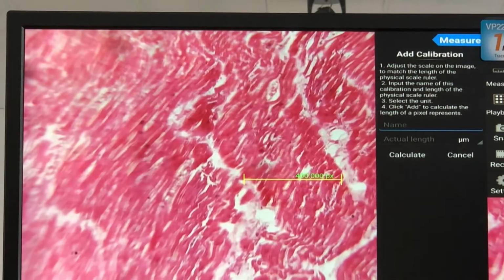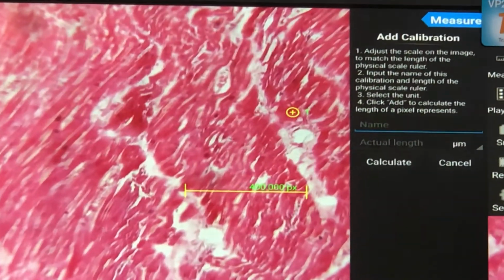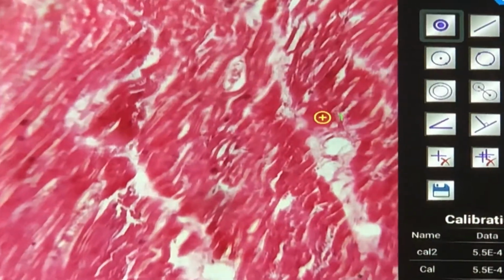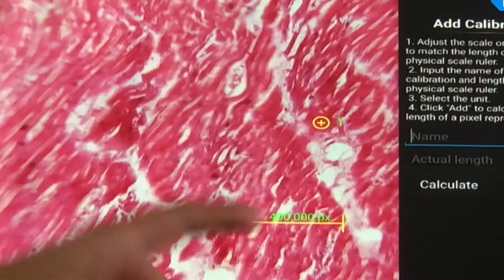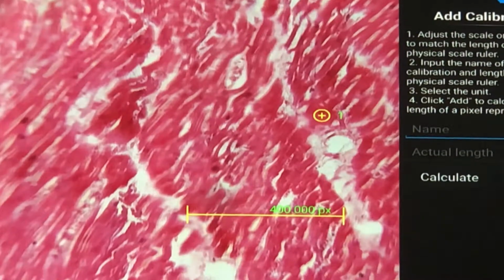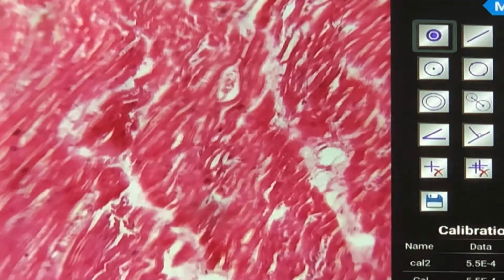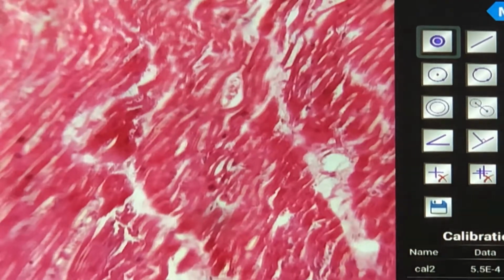So I will point to you in low power the hypertrophy. Did you see the pointer one inside the nucleus? When I remove the pointer, you will see that the nucleus there is big. Actually, in that cardiac tissue, the nucleus is big. It looks like a boxcar appearance.